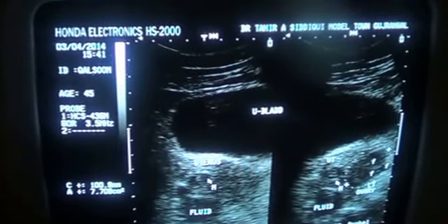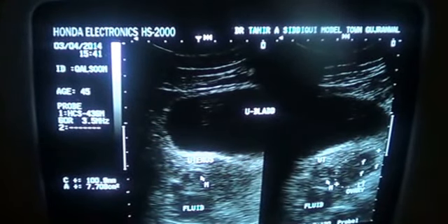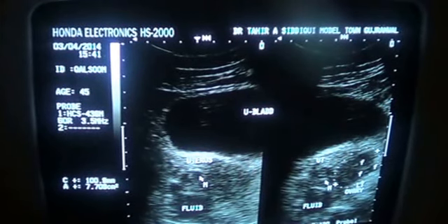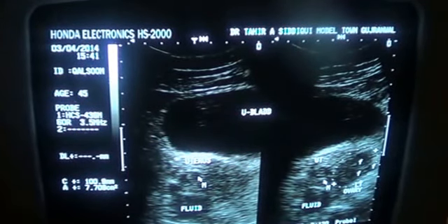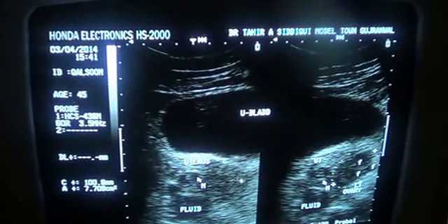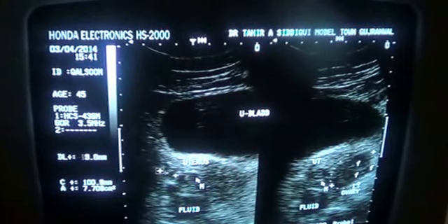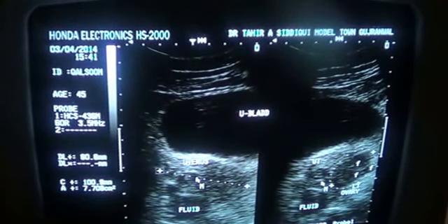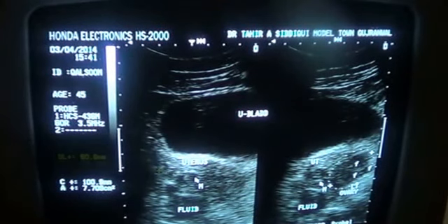In this video segment, that of a 45 years old female with a history of constant pain in the pelvic region. What we see here, in this image in front of you, is the anterior myometrium, this is the uterus in longitudinal section measuring 6 by 2.6 centimeters, and the patient says that she is not menstruating, is in menopausal phase.